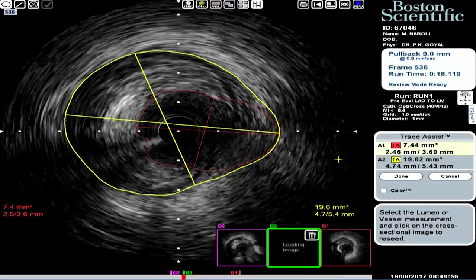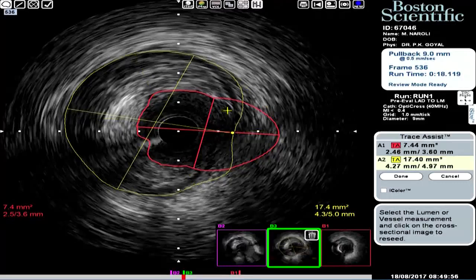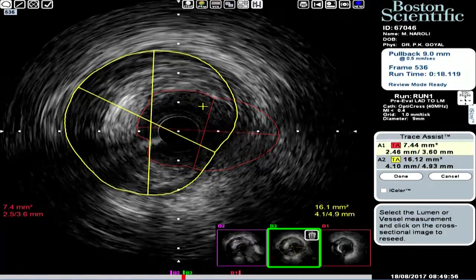We'll make our decisions based on that, okay? Because left main, whatever it is, is almost always treated like a bifurcation once you have to go beyond the left main into the LAD. Now the strategies will vary depending on how the circumflex is.